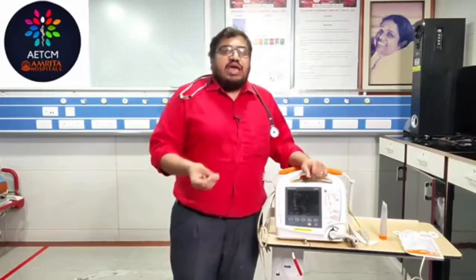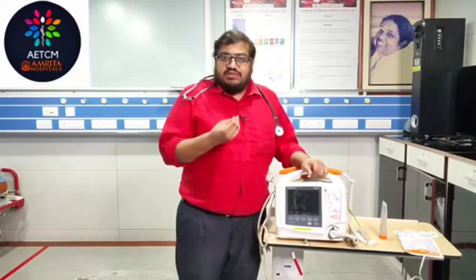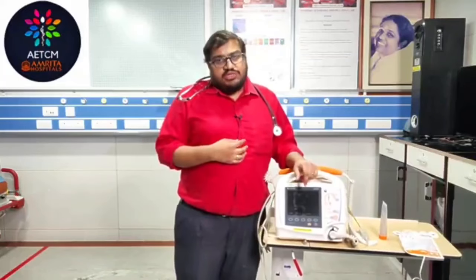So again, the question comes, what is the procedural sedation that is needed? For procedural sedation, you can use a smaller dose of midazolam or morphine or fentanyl. That depends upon your institutional protocol. So definitely that needs a sedation, and you need to explain the procedure to the patient and take a consent from the bystander if somebody is available. That is ideally how cardioversion has to be done.